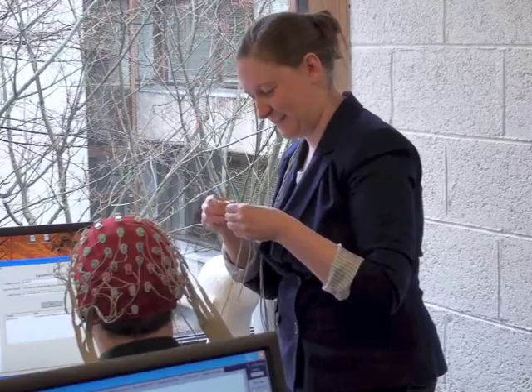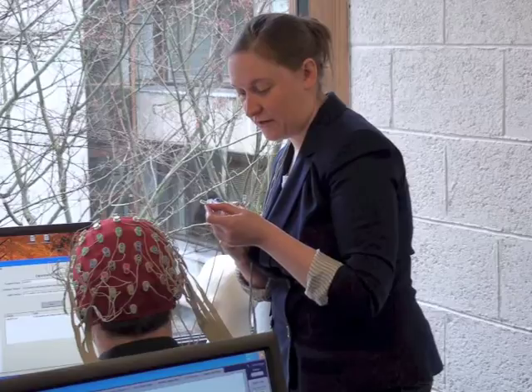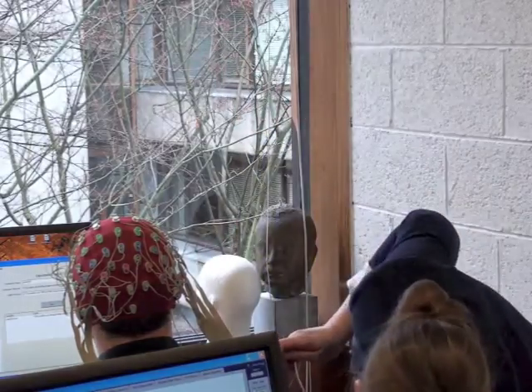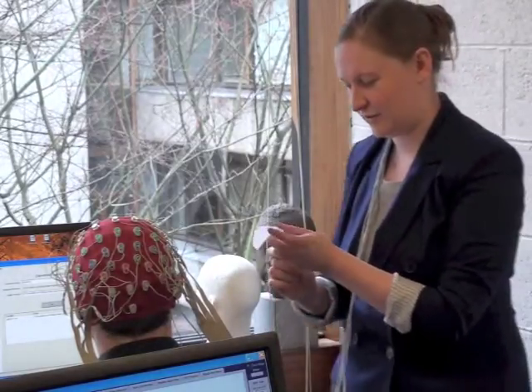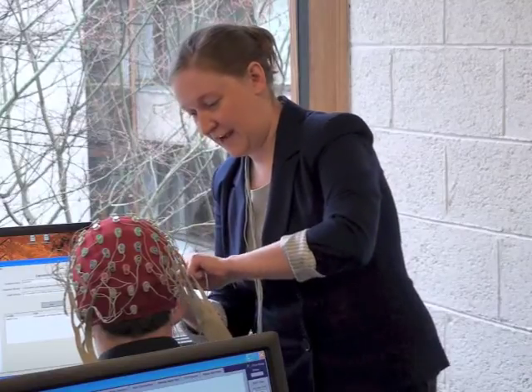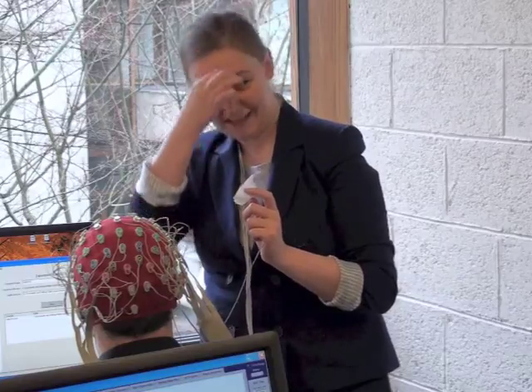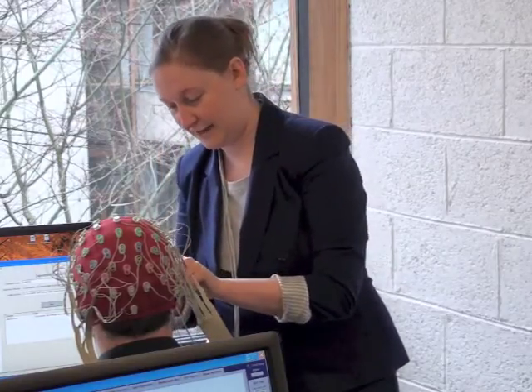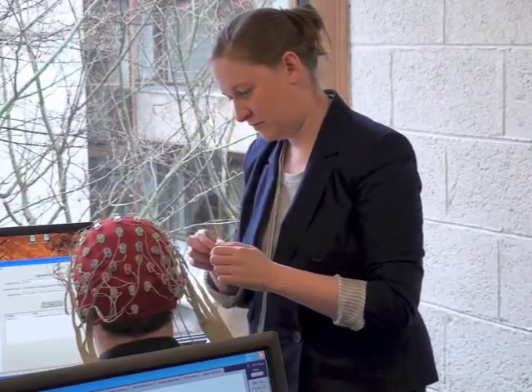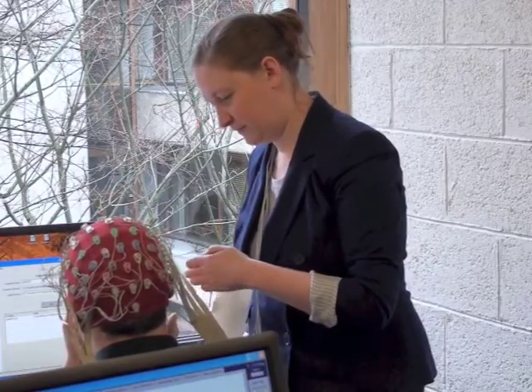Okay, so 5 and 6 go just under the eye on the left and right eye respectively, and these are pretty intrusive, because people can sometimes see them in the corner of your eye. I don't think this is a nice part of the experiment. 7 goes right between your eyes and 8 goes on the tip of your nose. So you can imagine, with a bit of sellotape, your whole face is pretty much bandaged up like a mummy. Can you move your nose okay?